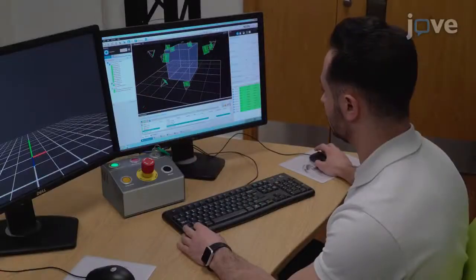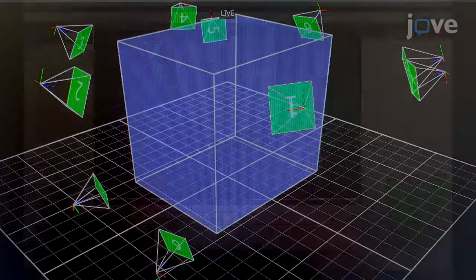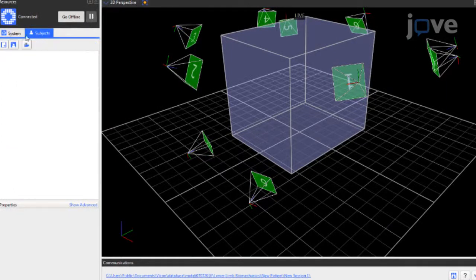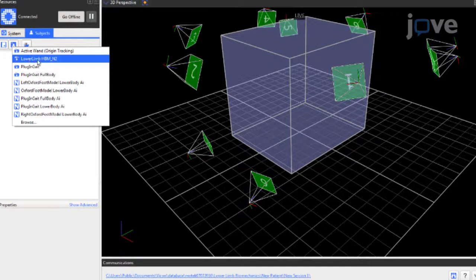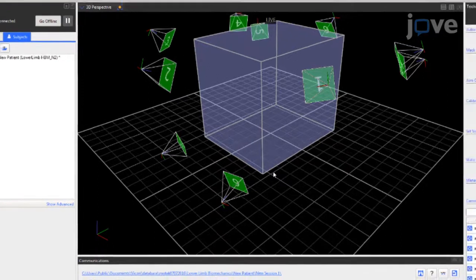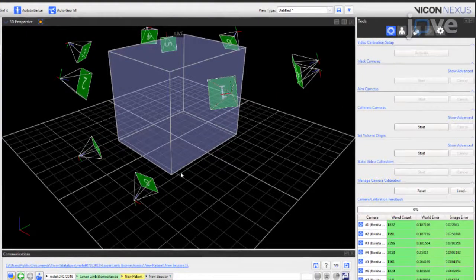Start a new session in the database, and make sure the session is active. Under the Subject tab, click the Labeling Skeleton button and navigate to the Lower Limb HBM-N2-VST file to create a new participant. Enter the name of the participant and click OK. The name of the participant will appear in the Subjects window.